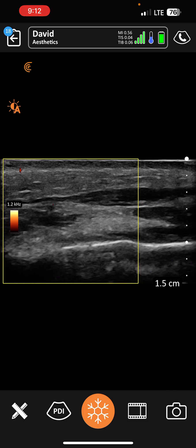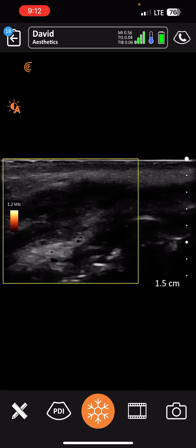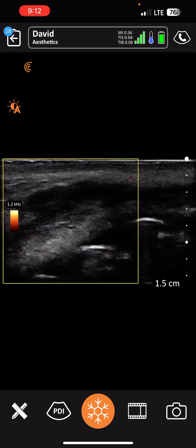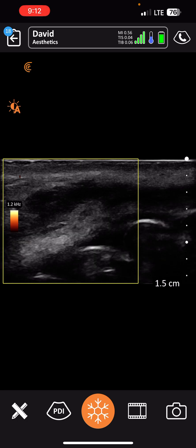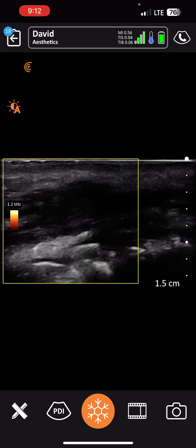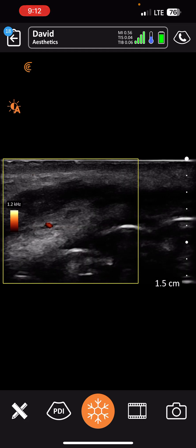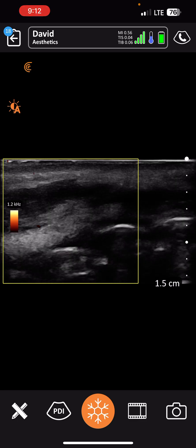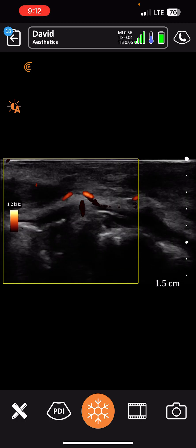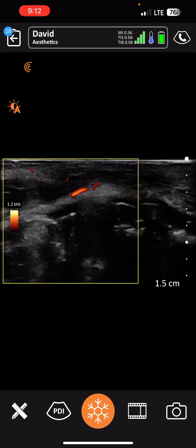Continuing to pulsate, kind of going up. See it pulsating right on that top right corner. We're going to go up into the inferior labial artery right there, and then you can see the top one — that's where it's branching into the superior on the top of the screen. Really beautiful blood flow. Really pretty blood flow.